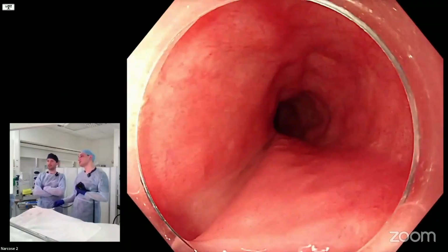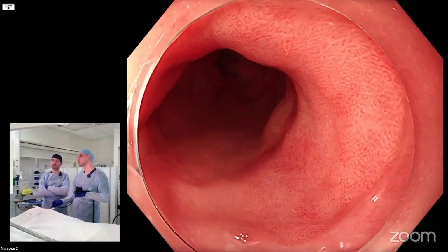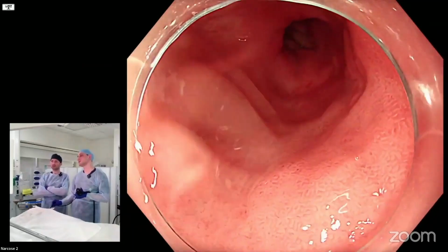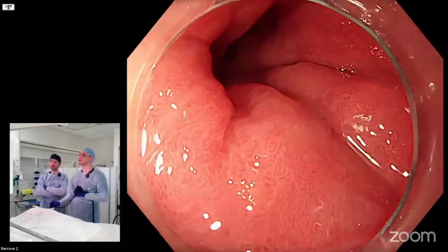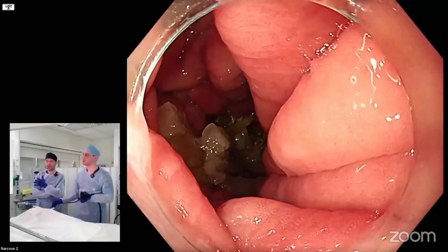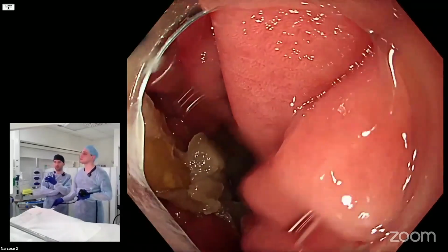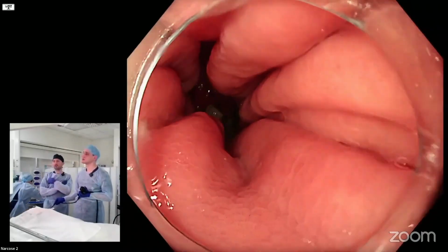So the basics that the everyday endoscopist needs to understand about assessing Barrett's. I would say go to the stomach, find the diaphragmatic pinch, because let's take the measurements first, shall we? We've done an overview, we've looked, we didn't see anything major. There's food in the stomach, so we have to be careful, and it's not clear. That we'll just ignore for now. All right, find the diaphragmatic pinch.